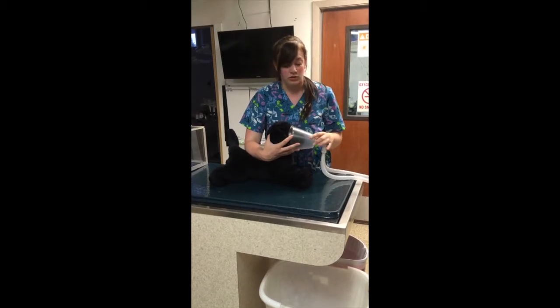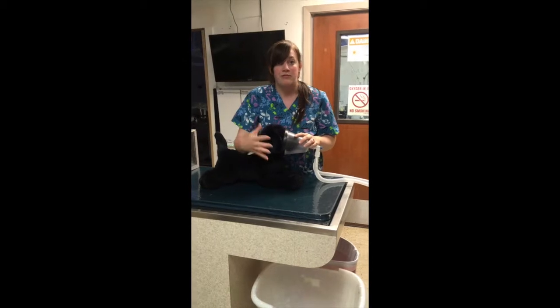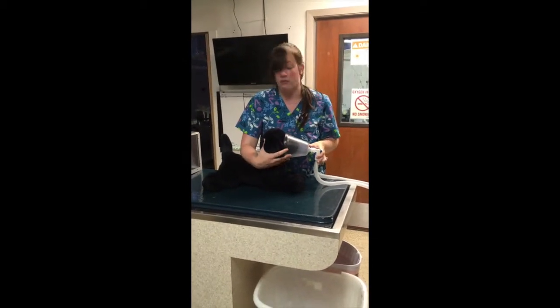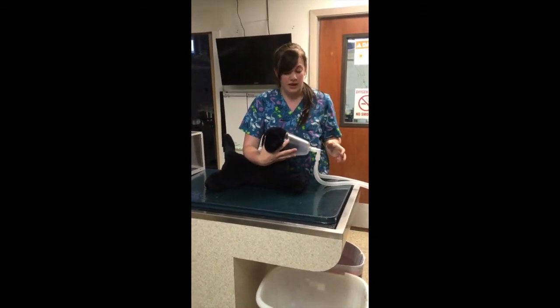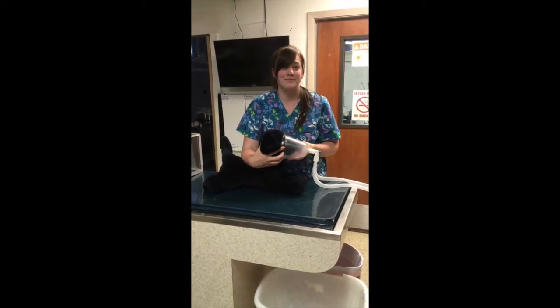The patient will inhale and exhale however they want to. If they're a little bit nervous and they're inhaling and exhaling, breathing fast, that's perfectly fine. They can breathe however they want to, but this is a way to anesthetize patients through mask induction.